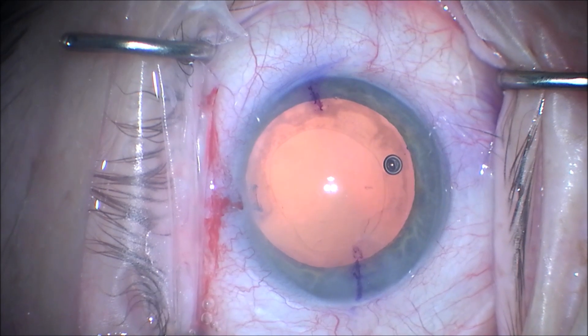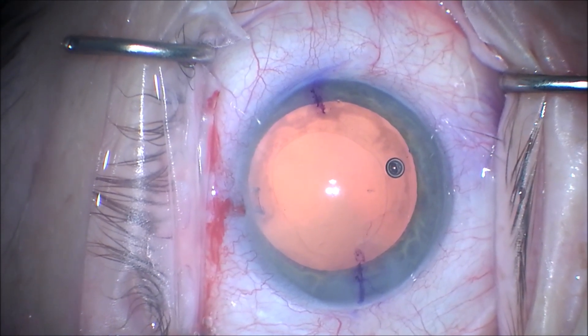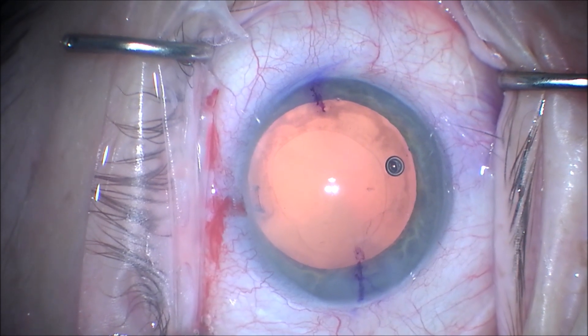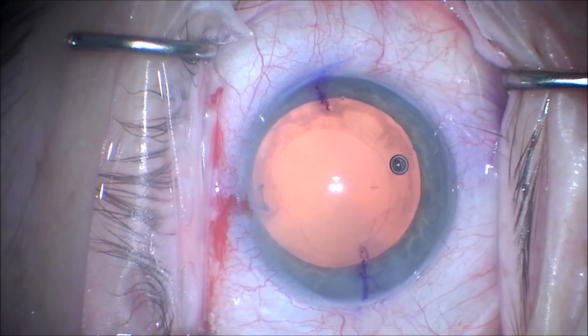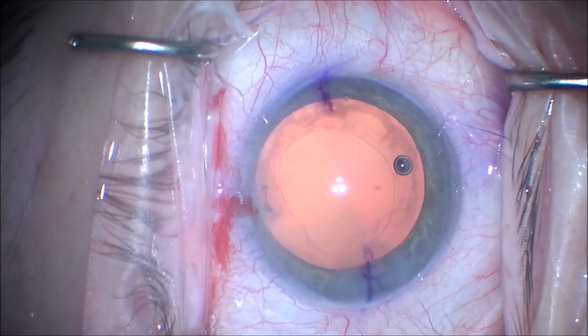I do not routinely clean the anterior capsule or perform vacuuming, as I find this helps toric lenses stay in more stably if the anterior capsule leaflets are not polished.